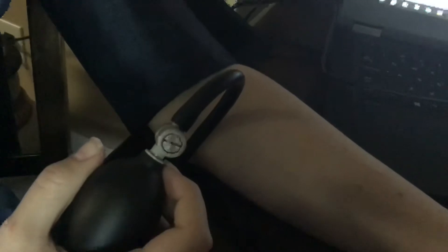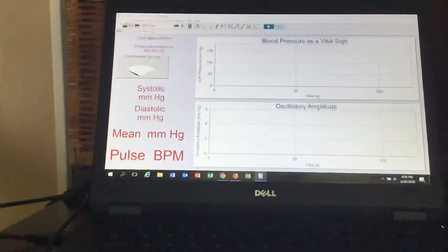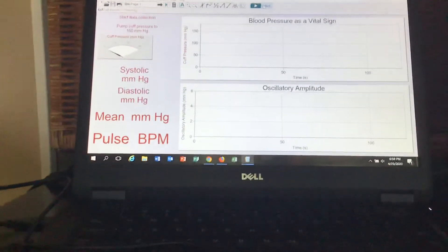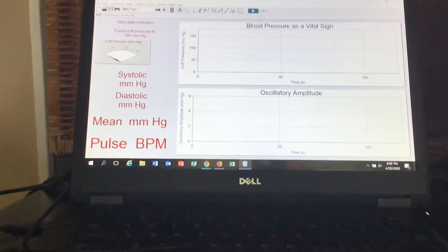So it can accurately, or hopefully accurately, pick up your blood pressure systolic over diastolic. Obviously it's hooked up through its GO Link. Hopefully this thing is pretty sensitive - we've done this a few times, sometimes it works, sometimes it doesn't.